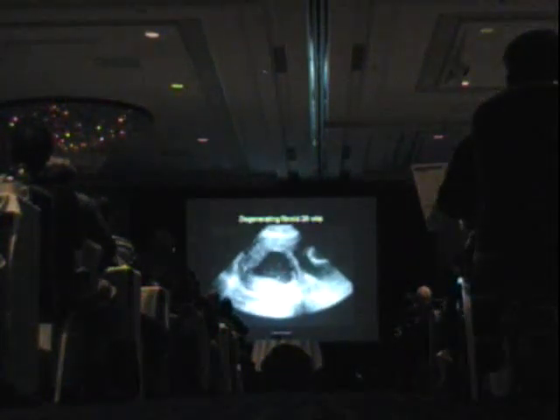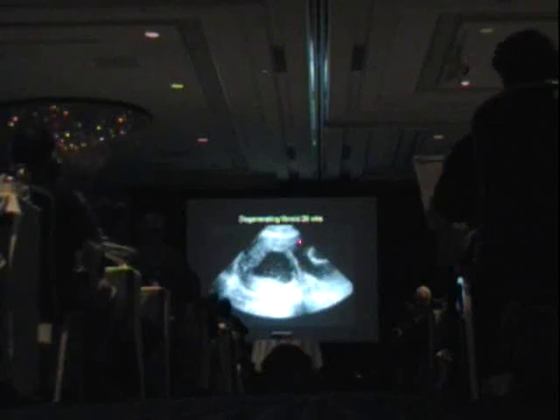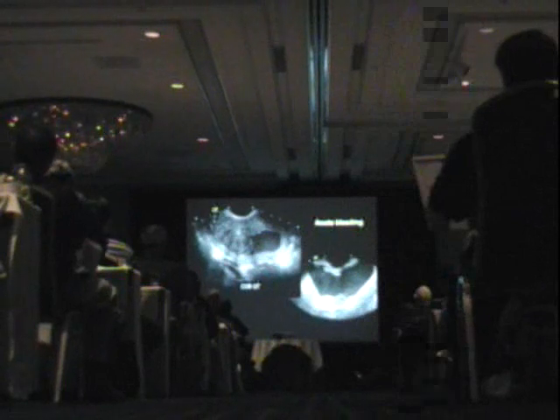Particularly during pregnancy, fibroids can undergo degeneration. Fibroids, we know about a third of them grow during pregnancy, a third stay the same, and about a third shrink. So this one grew rapidly, outgrew its blood supply. Here you can see some fetal parts, amniotic fluid, the edge of the uterus, and this big fibroid hanging off the side, which is necrosed and is filled with complex fluid and debris. And those can be quite painful.